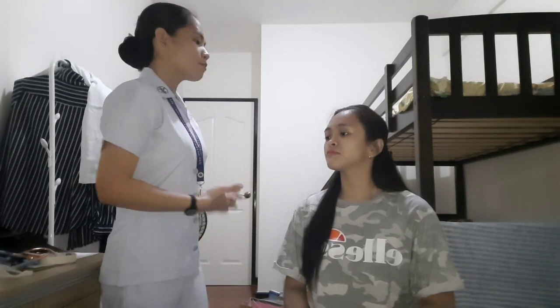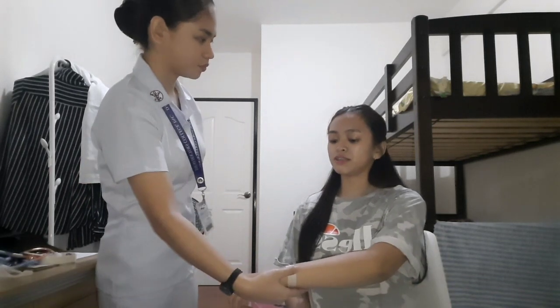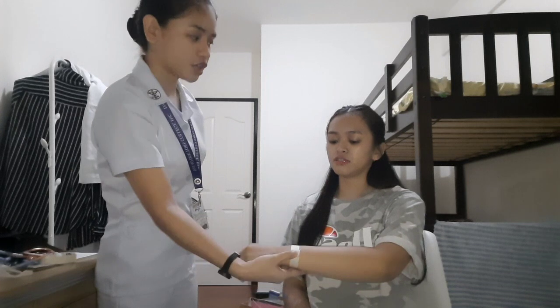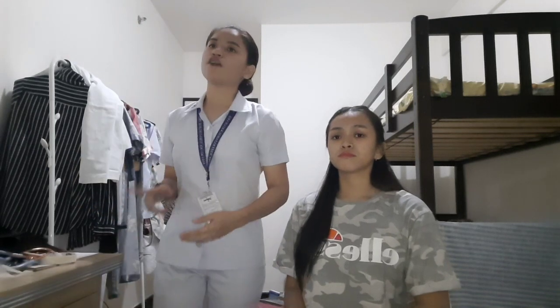So, ma'am, I'm Kyle Angeline Pioquinto, your student nurse for today. What's your name? My name is Kate Belen Epitugo. Your birthday? December 15, 2003. Okay, thank you. So now I'm going to measure your blood pressure. Is it okay with you? Okay, thank you.